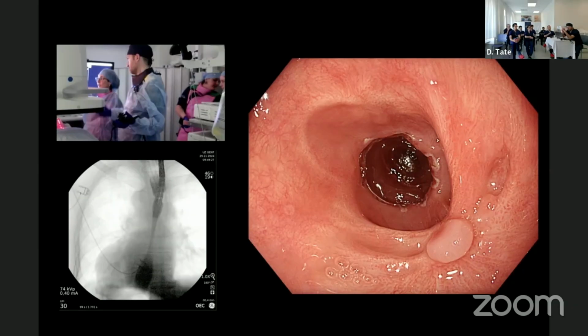Yes, so that's really important. Thank you for reminding me to talk about follow-up. This patient immediately gets a plan for the next dilatation based on, and how is this based? It's based on the type of stenosis. So in this case, a post-ESD stenosis, the number of times we needed to do it before, and the stricture that doesn't get better. The refractory nature of the stenosis is the next thing. And so these patients, if you leave them too long, like 4 or 5 weeks between, it just goes back to 0. So you have to have a structured period of dilatation for these people where they keep coming back every couple of weeks and you keep progressing it.